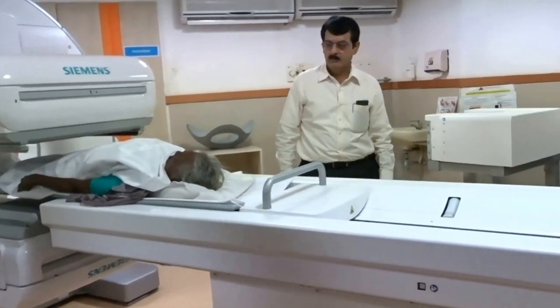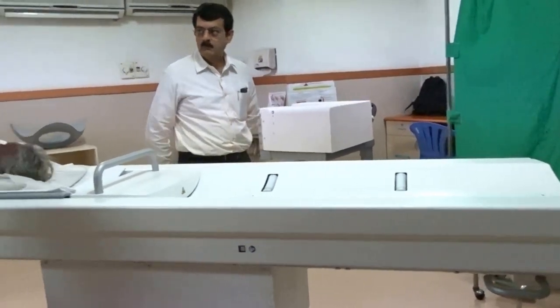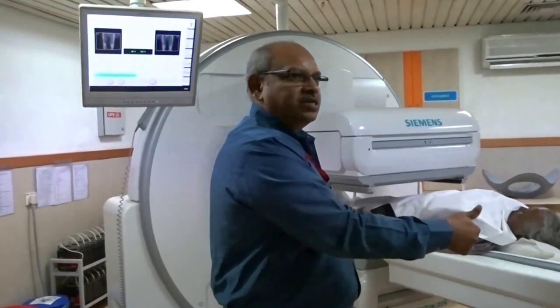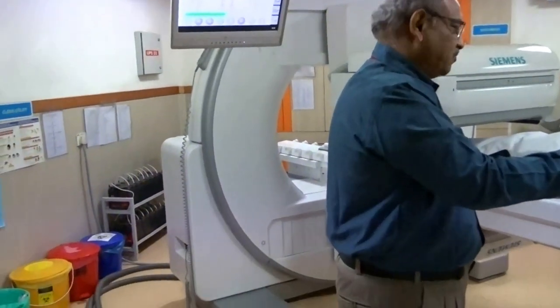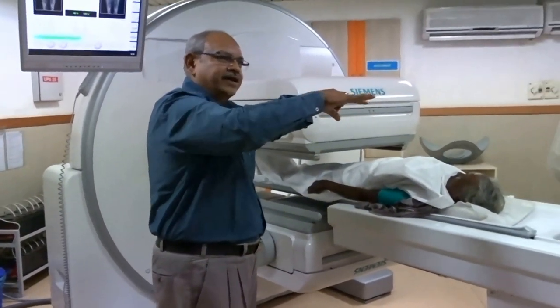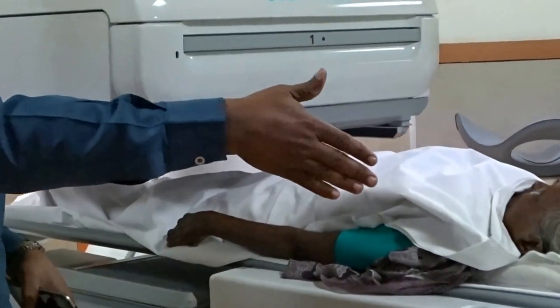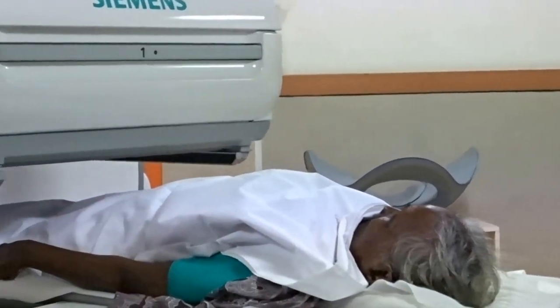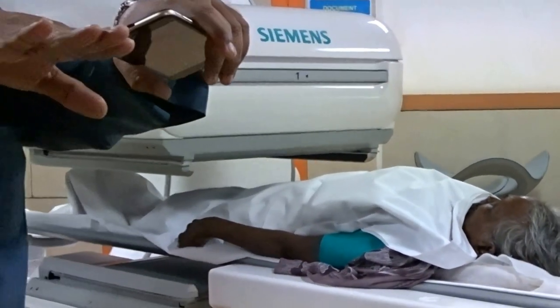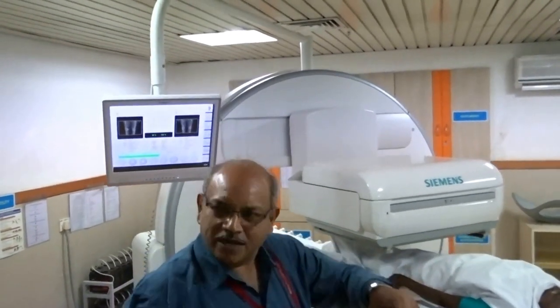Another thing, as Mr. Suthi told, if a kidney transplant patient is coming in on a stretcher, we need not shift the patient to this table, which would put the patient under a lot of discomfort. Both the detectors can come to the side and you can take the picture accordingly. The patient need not be shifted to this imaging table. Both detectors will come side by side so that the stretcher can be put under the detectors and the scan emitter.